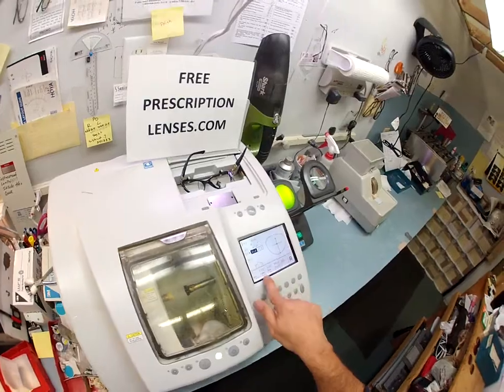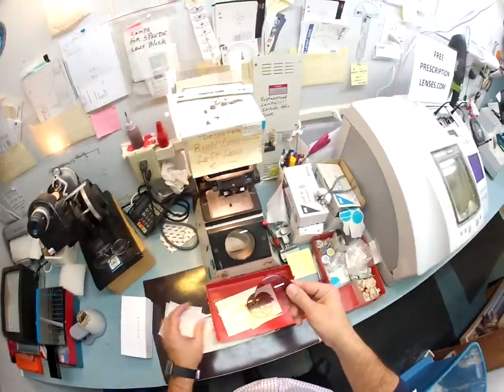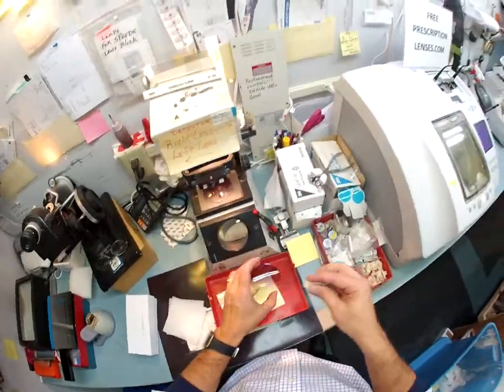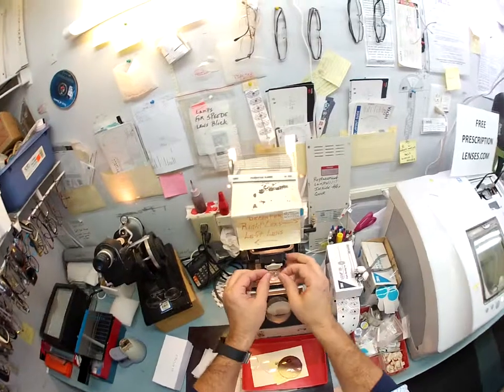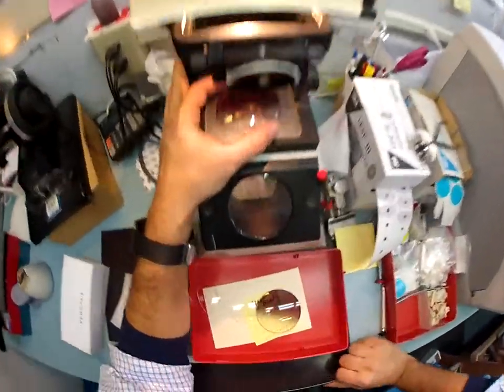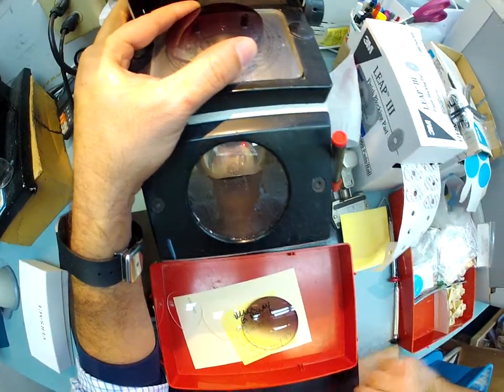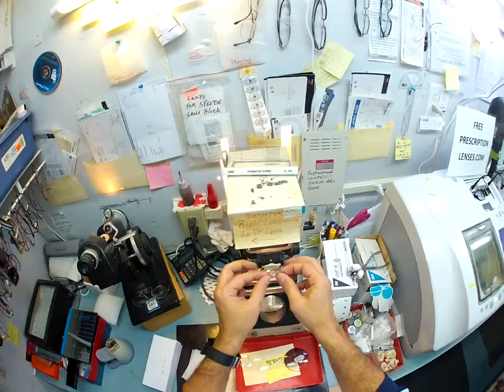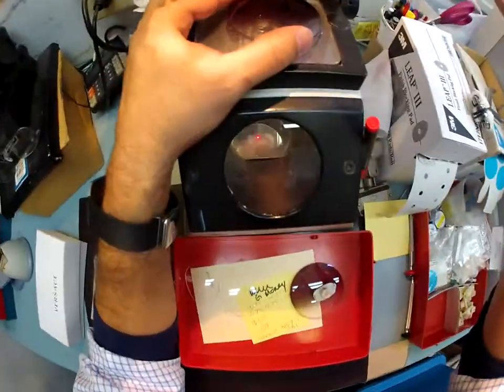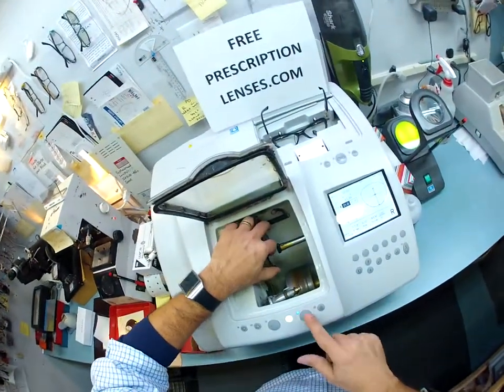Let me pull out your lenses — that is your left lens, this is your right lens. I'm going to line it up. I need to put a block on there to hold it in place while it is cutting, so I'm going to attach a double-sided sticker to your lens and line everything up perfectly — get that optical center just right. Then I'm going to put your lens into the chuck. Hello chuck.